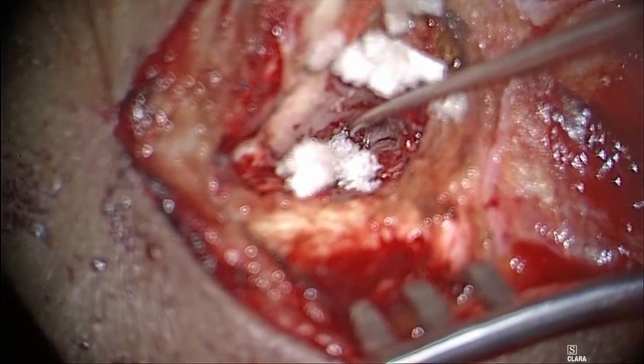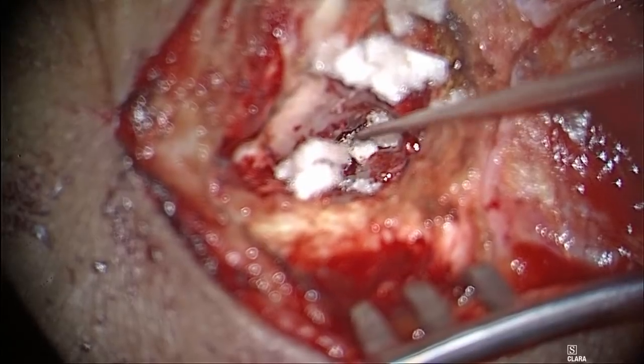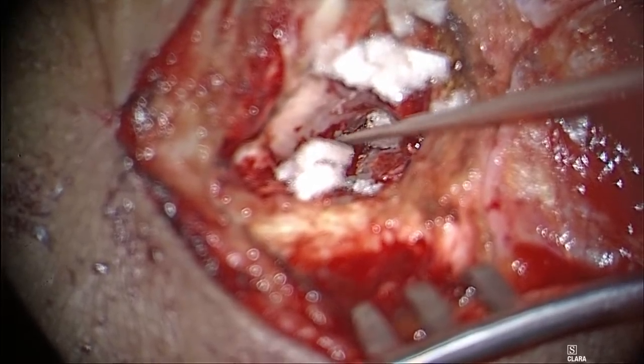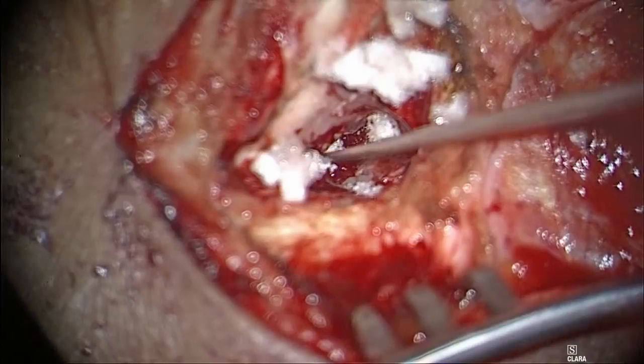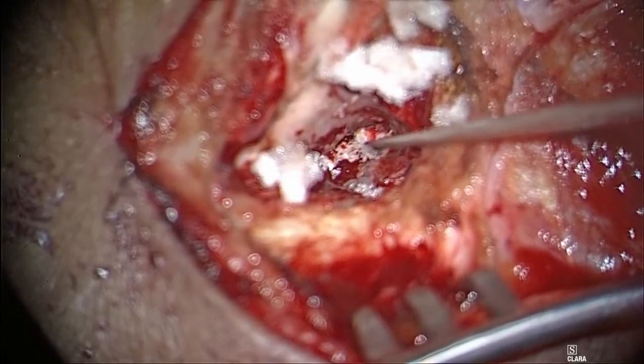Basically, there are onlay, interlay, and inlay. In the interlay, what we do is place the graft between the mucosal and the fibrous layer. I think there are various methods to skin the cat. I am getting a good success rate with this. Why should I change? I have no issues in my inlay type of grafting, so I don't want to change. If I feel that I have a lower success rate, then I might change to interlay grafting. But at the moment, I don't have any problem with this at all.